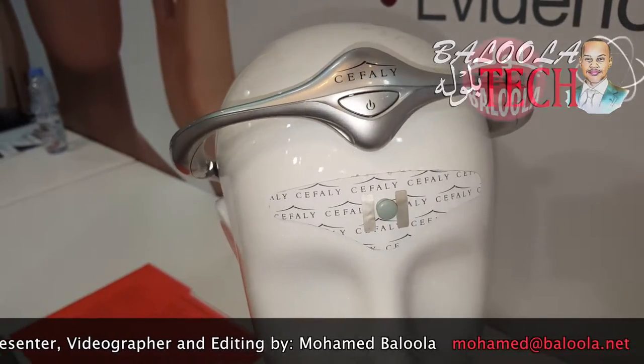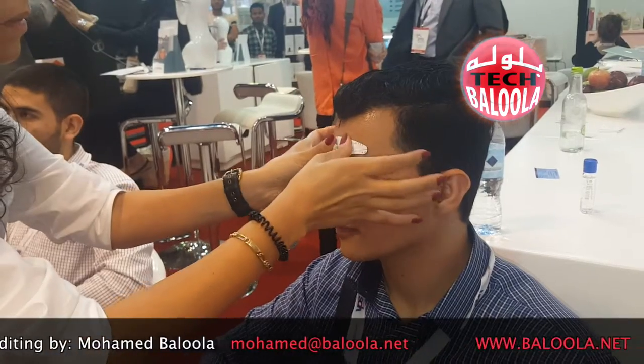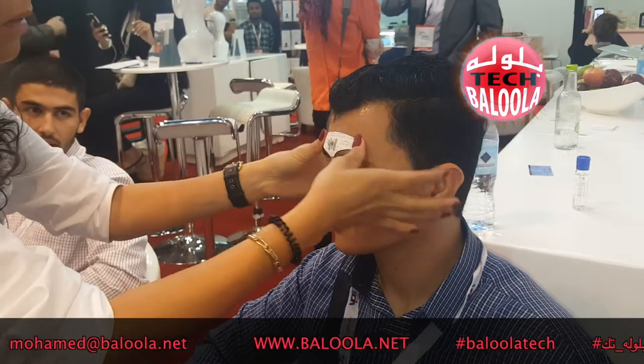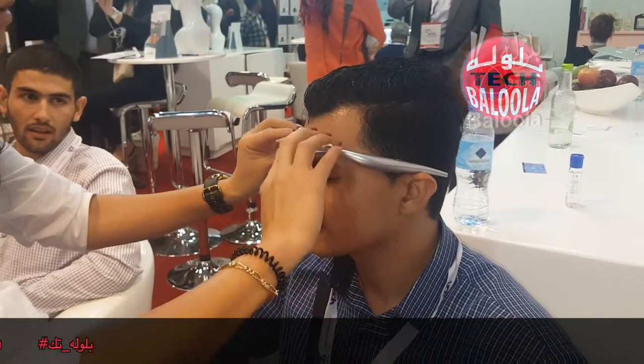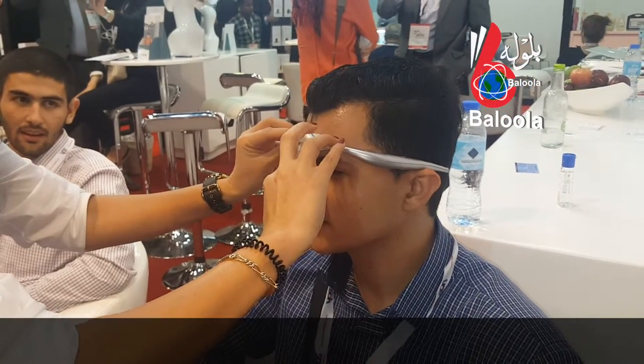For how long do they have to use it? A minimum of 20 minutes, but it could be a maximum of 60 minutes. And this is an FDA approved device. They can use it for the normal headache? Yes — normal headaches, severe headaches, mild headaches.